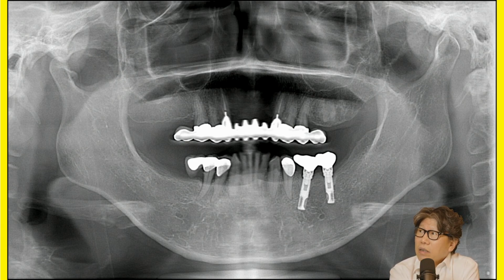He's still treating 12 prostheses with 6 teeth in the maxilla. This is a Brånemark implant, and this is a 29-year-old, almost 30-year-old implant. I think it was a gold abutment. It's so old that this is the gold. This one hasn't come loose.